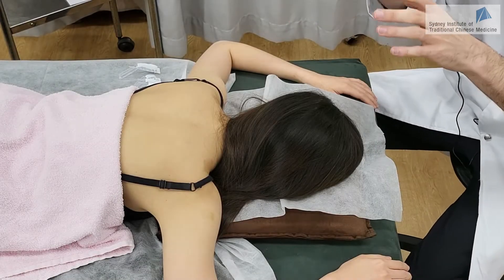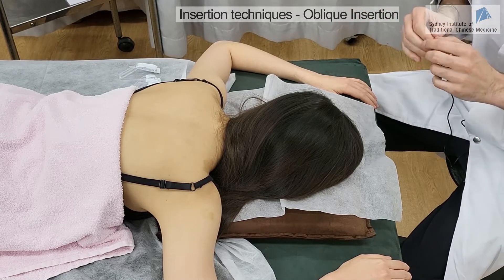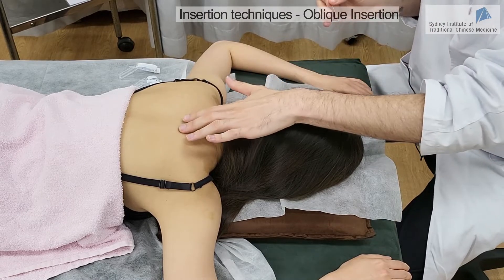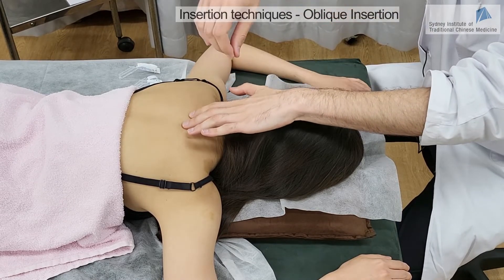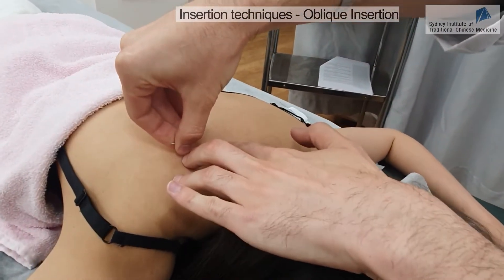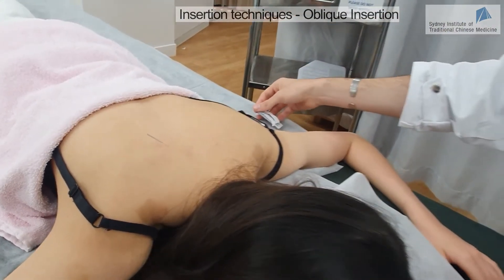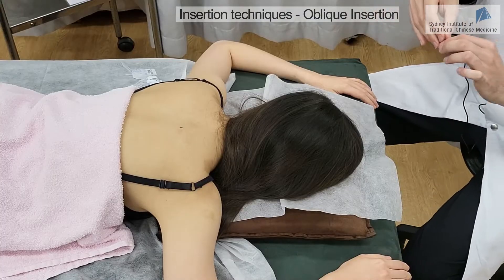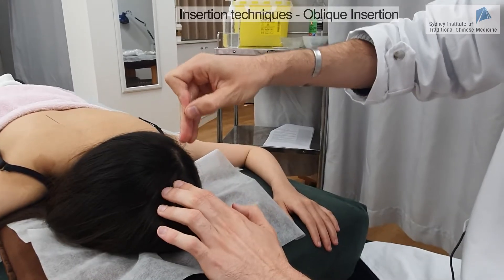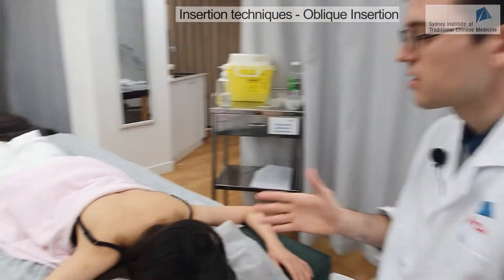For locations such as the upper back or the scalp, you will need to do oblique needling, because there is not enough space to do perpendicular needling. For example, if we want to needle on Bladder 13, you will have to needle towards the spine, so the insertion will be like this. You don't want to be too deep, otherwise there is a risk of pneumothorax, so that will be enough. And now I'm going to do GV20, needling in an oblique manner as well. This is the oblique insertion.